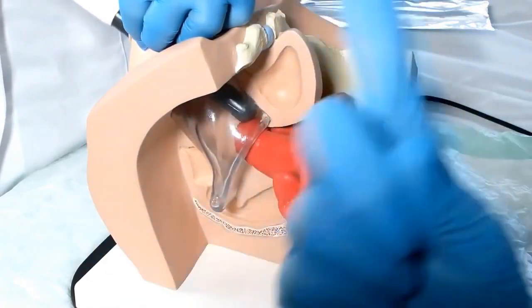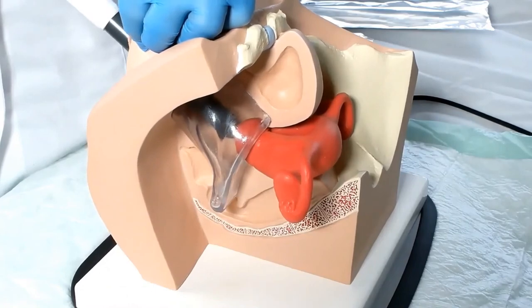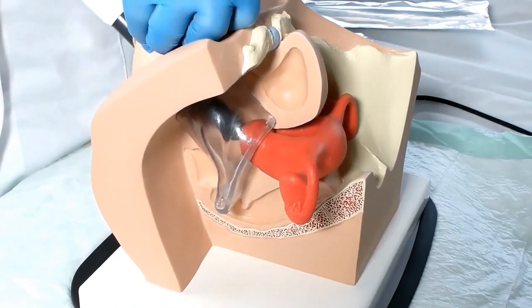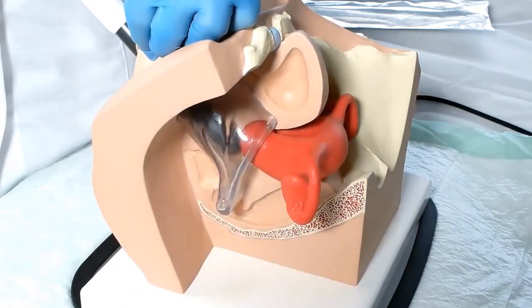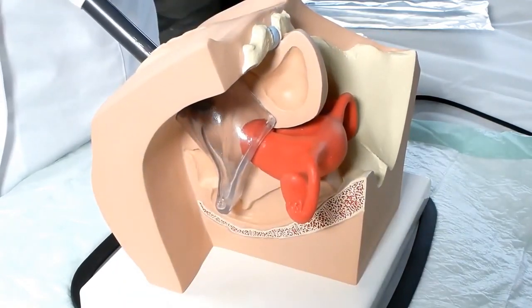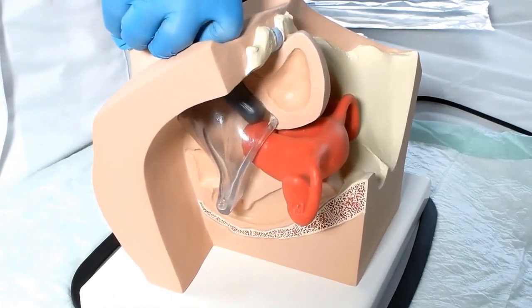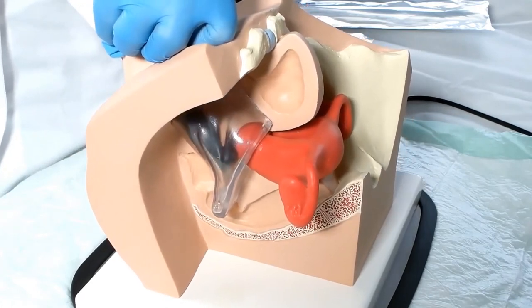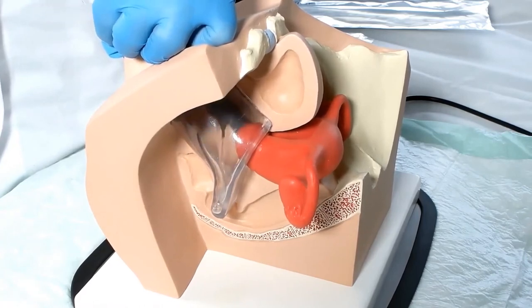If the electrode offers resistance, please do not carry out the treatment without medical supervision. Apply at one minute intervals onto each of the walls of the vagina. This is the correct way.